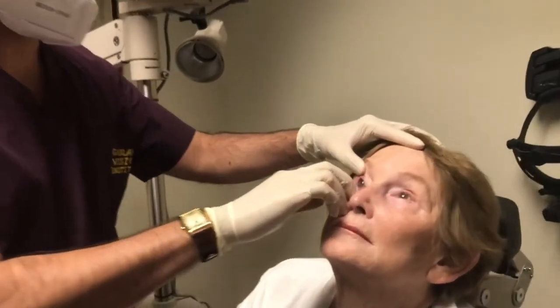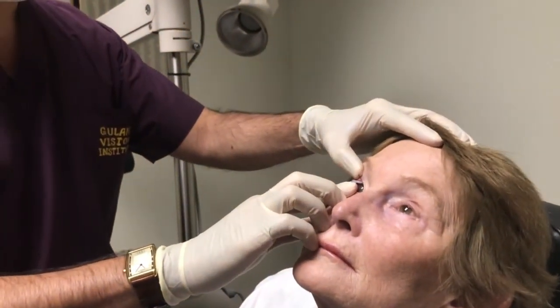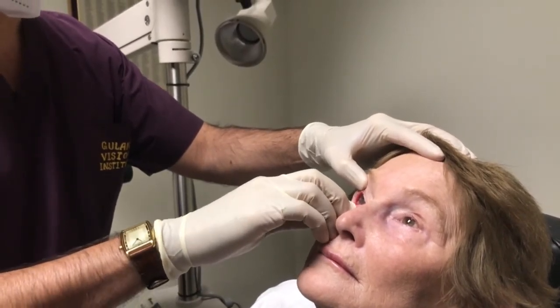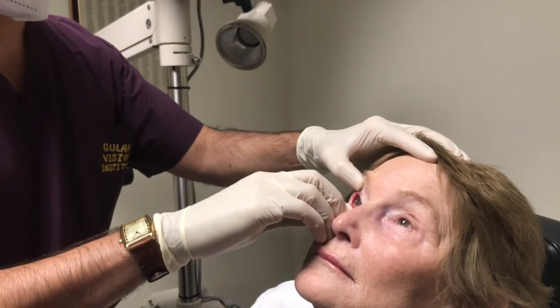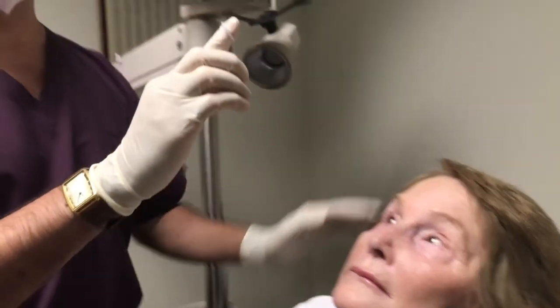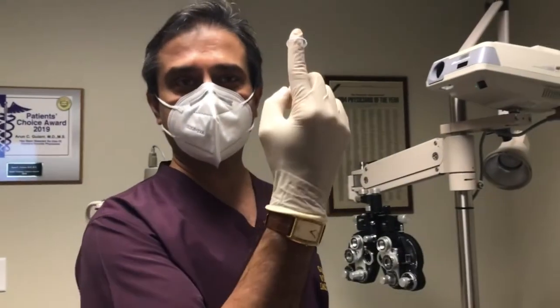My style for removal is I just go in like this and lift it up. The patient feels no pain as I slide it out. I'll do this again just to show you — I go underneath the lid and flip it up. You see how it literally hooks up and I bring it up. That's my style — the ring technique, let's call it.